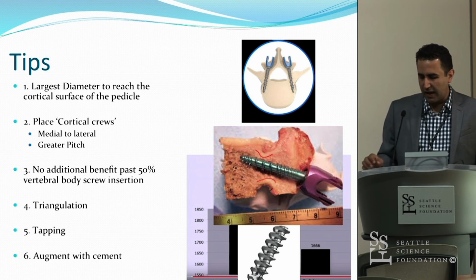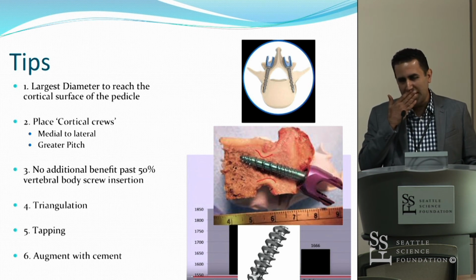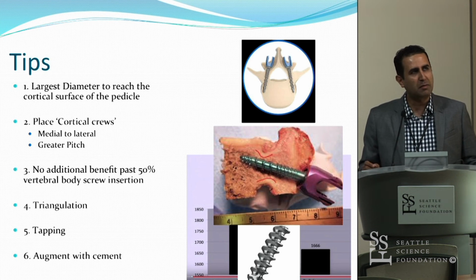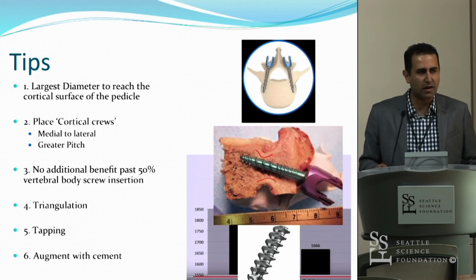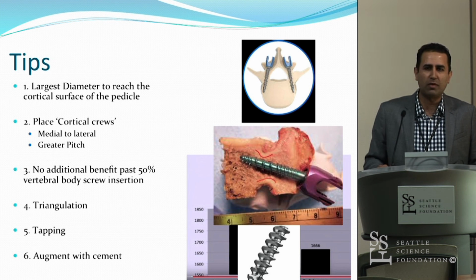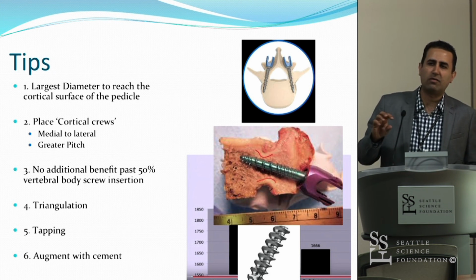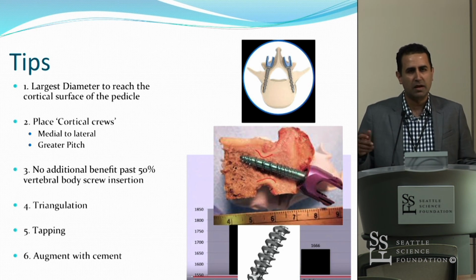Tapping's become more optional as I've gone through my training. I started by all my teachers, mentors telling me that I needed to tap. And I think as we've become more expedient with our instrumentation, and we have more time pressures on us, I've noticed that we're tapping a lot less these days. The problem with tapping is that it reduces your bone surface, actually removes bone up to about 20% by doing that. And that's an issue.